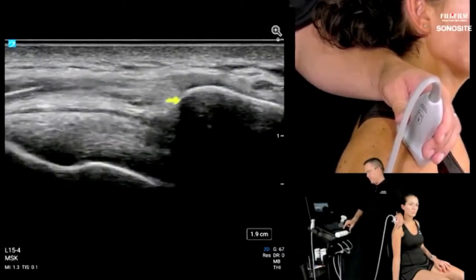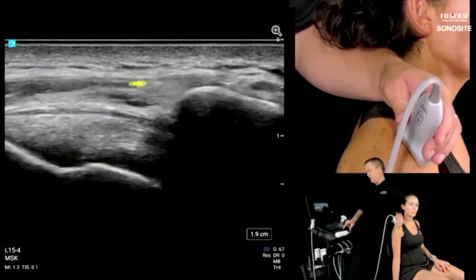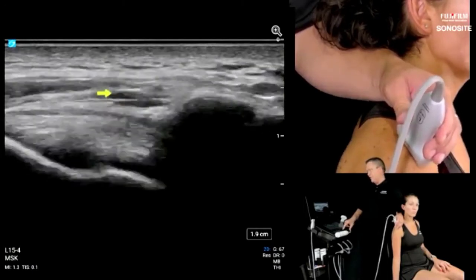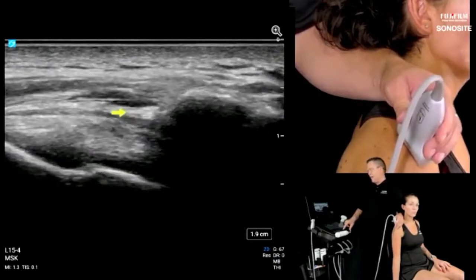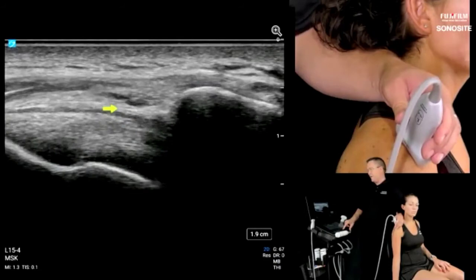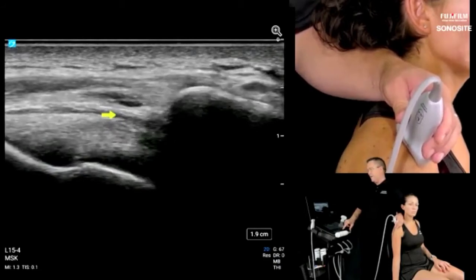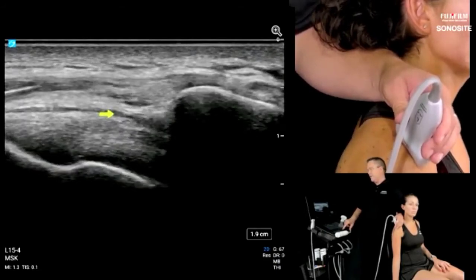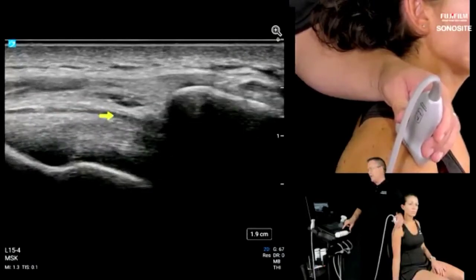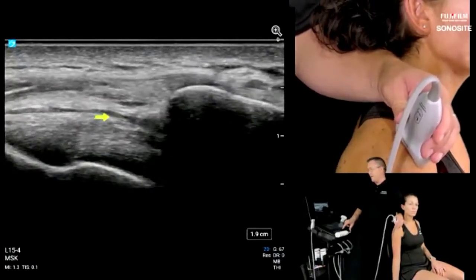So I zoomed in a little bit. So here's the acromion, here's the deltoid tendon, right? So this is a tendon of the deltoid muscle. Here's the muscle of the deltoid. This is the subdeltoid fascia right there. So it's connected to the overlying deltoid. Underneath that is a layer of peribursal fat. And then in this little interface here is the actual potential space of the bursa. Underneath that is peribursal fat. And then we have the peritendon of the supraspinatus, and we have the supraspinatus.